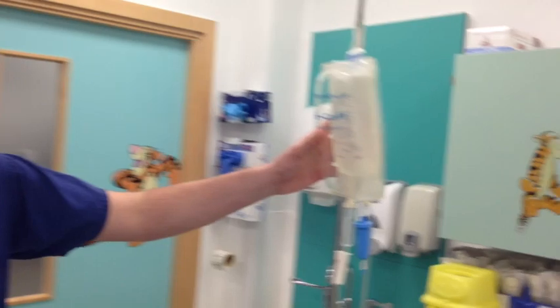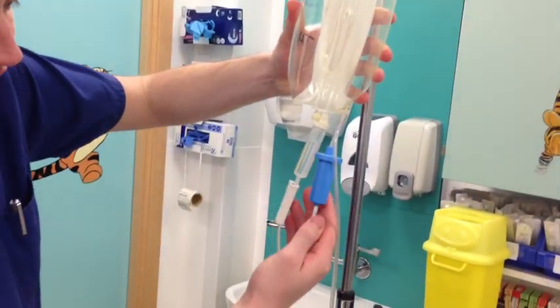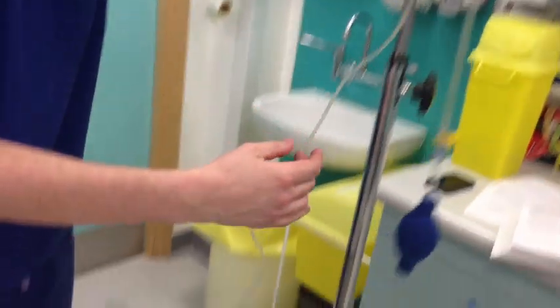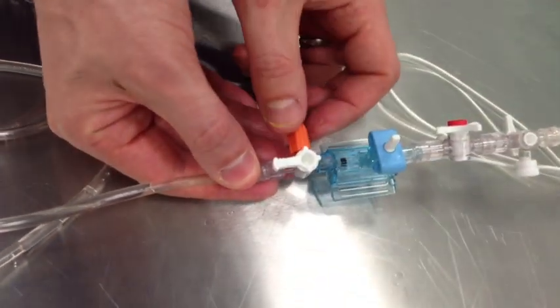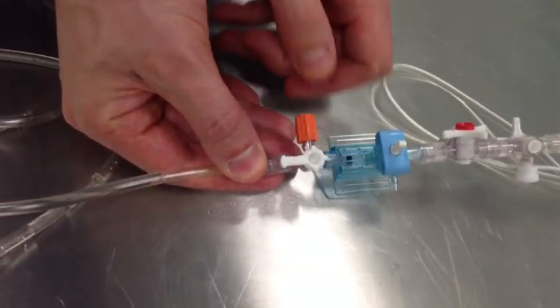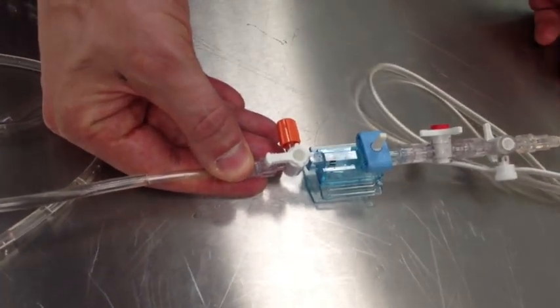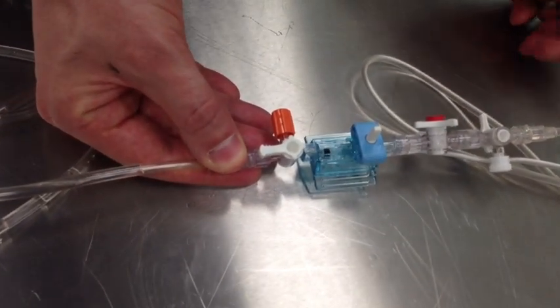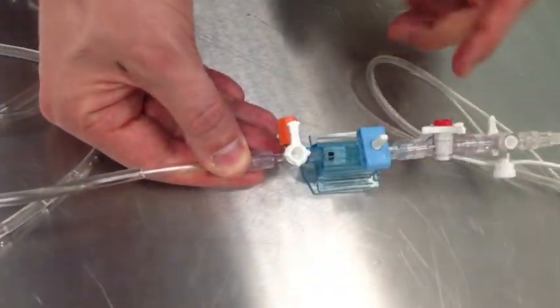How would you perform zero calibration of the transducer? I would first check that the transducer is correctly pressurised at the flush end — it is, at 300 mmHg — then follow it down to the pressure transducer. I would turn the stopcock off to patient and open to air, press zero on my electronic monitoring system, wait for the zero to be completed, and then turn it off from air and open it back up to patient.